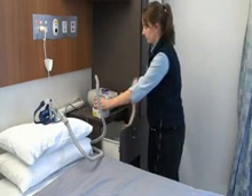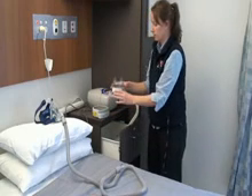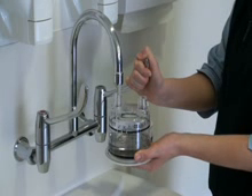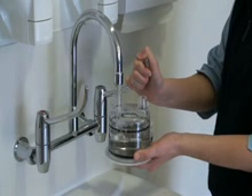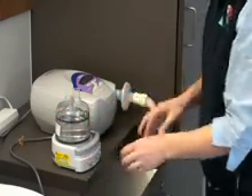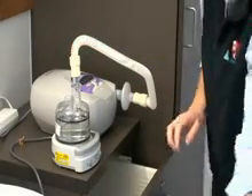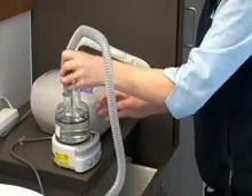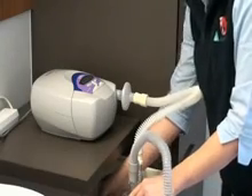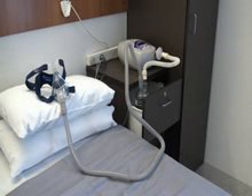Detach the humidifier chamber from the humidifier base and disconnect both breathing tubes. Fill the chamber with clean water up to the line and re-attach to the humidifier base. Reconnect both breathing tubes. Turn the humidifier power button on to heat the water — there will be a green light when it is turned on. Return the humidifier to the drawer, being careful not to spill any water. For more information on setting the temperature control, refer to your discharge education book.